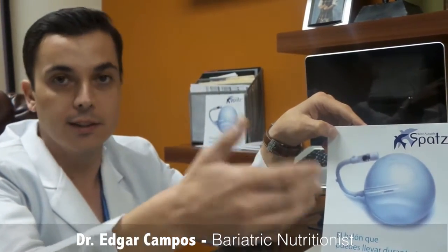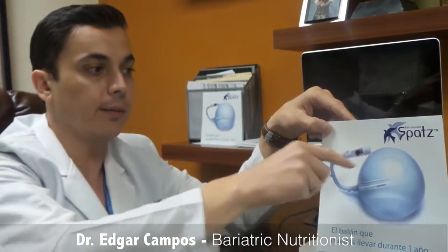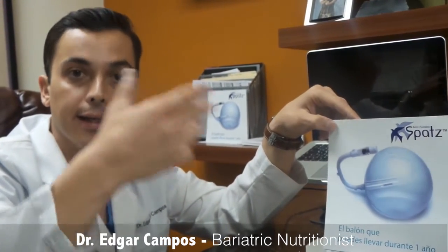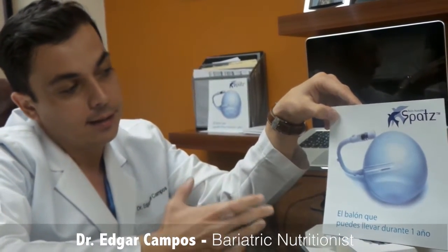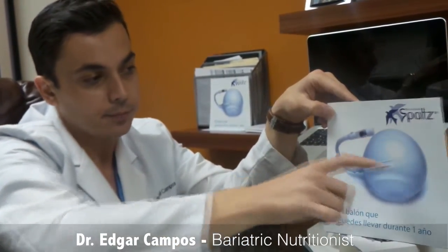We can fill the balloon with more liquid and adapt it to your needs. That means that if after four or six months you stop losing weight, we can go in through the endoscope, pull this tiny valve, and add more fluid to your balloon — so you'll feel satiety again, feel more fullness, and then you'll keep losing weight.